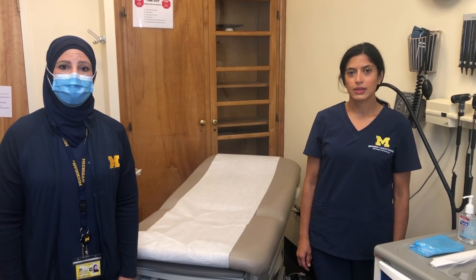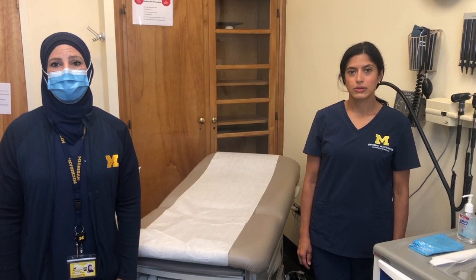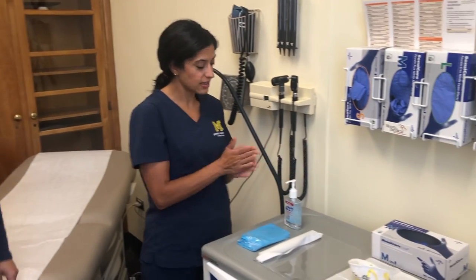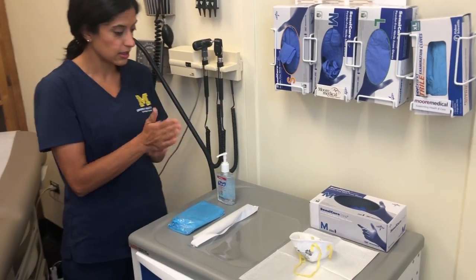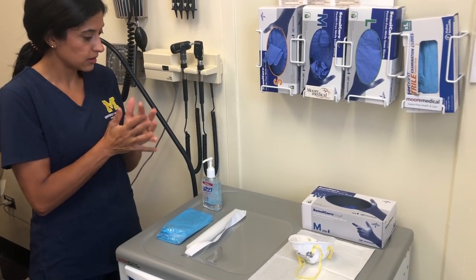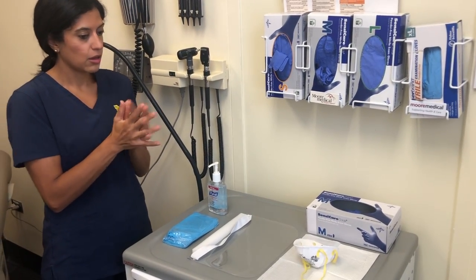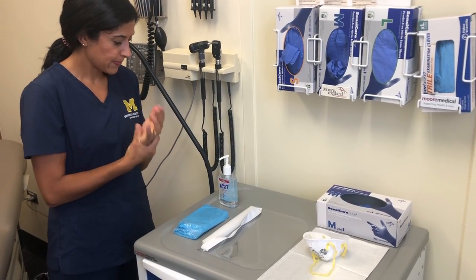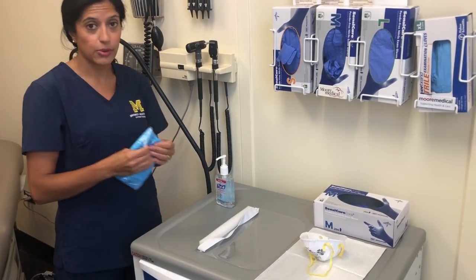Of course, normally PPE would be applied outside of the patient's room, but for video purposes, we're going to show you now. So first you're going to want to hand sanitize or wash your hands. Remember, this should be done for approximately 30 seconds. But I'm going to show you the abbreviated version here.